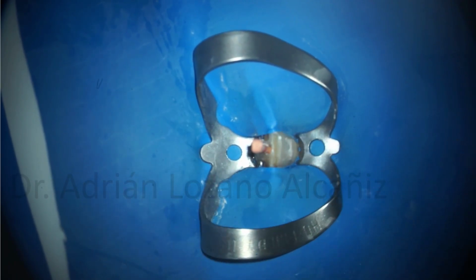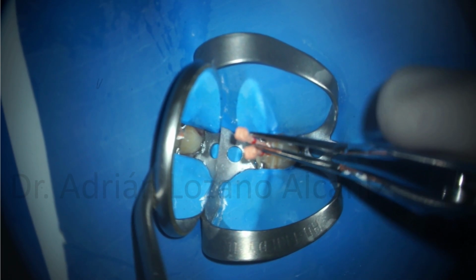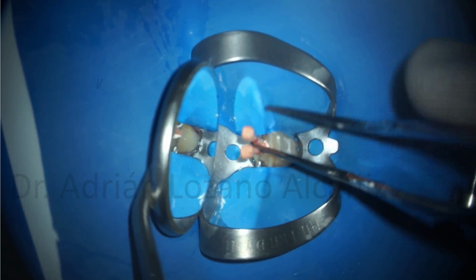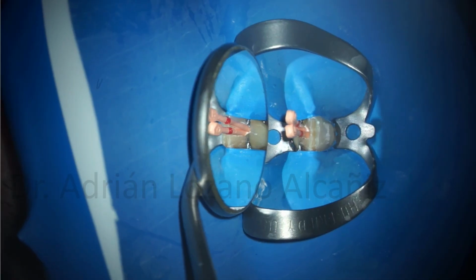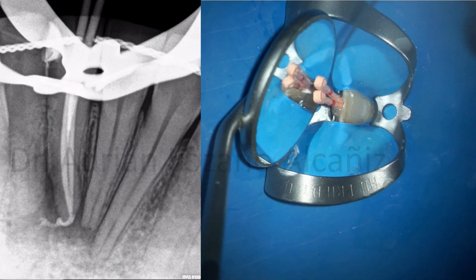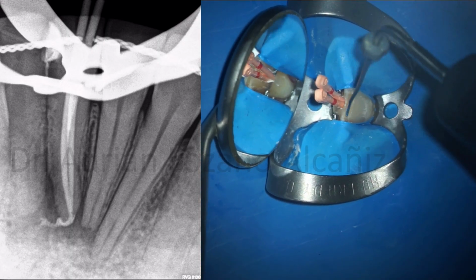Here we don't have to do the pumping motion. We have to go directly to the apical, to the working length, because if we do the pumping motion, we can obtain bubbles or bubble lock. So it's easier to go directly to the working length. Then we take an X-ray, and if it's okay, we cut at the orifice level and plug the gutta-percha.